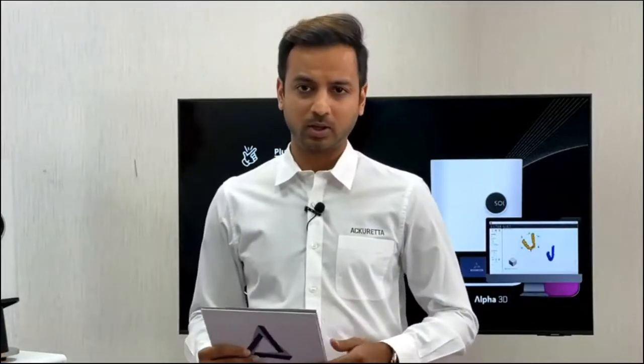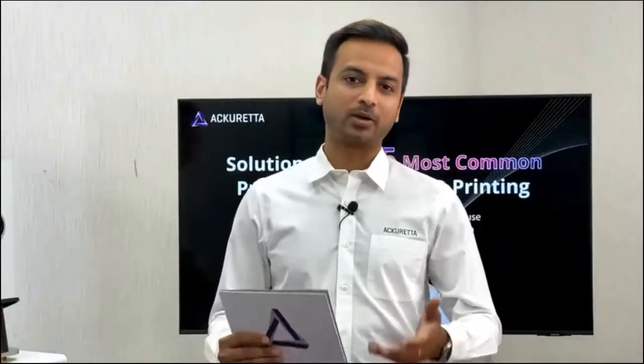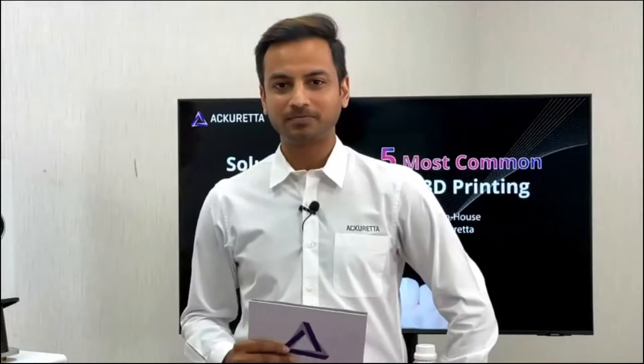Well, the short answer is I would say 45 minutes is a good benchmark, depending on the guide. Of course, a larger guide would be closer to 1 hour, and we've seen certain smaller guides even being done in 30 to 35 minutes. So rather quick and perfect for same day.